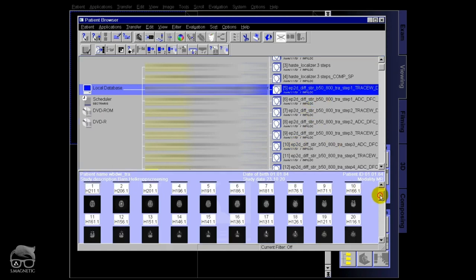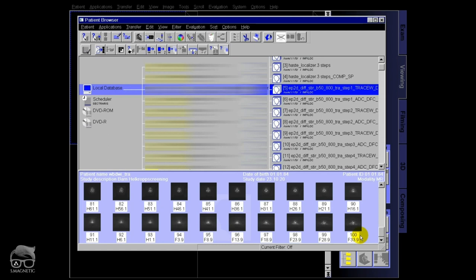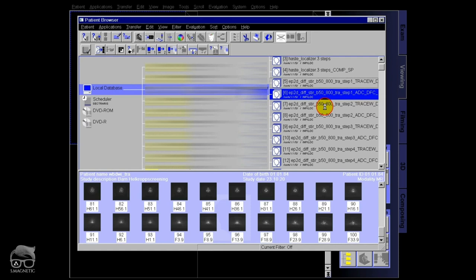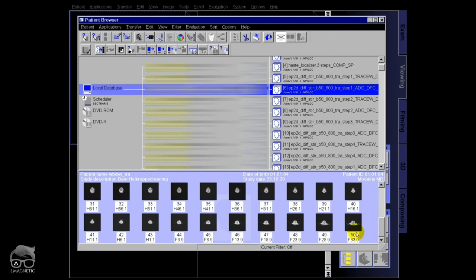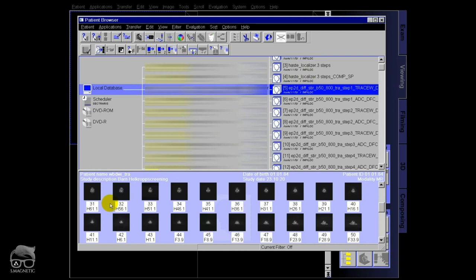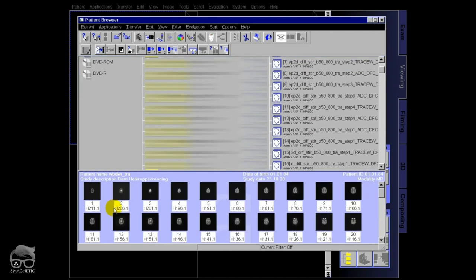In this stack of step one you have two b-values. Each sequence consists of 50 slices — 50 slices of b50 and 50 slices of b800 — that's why you see 100 slices down there in one stack. If the math is difficult, you can just check the ADC, because the ADC only consists of ADC images — it says 50, so it's easy to verify. What we're going to do now is split this manually.